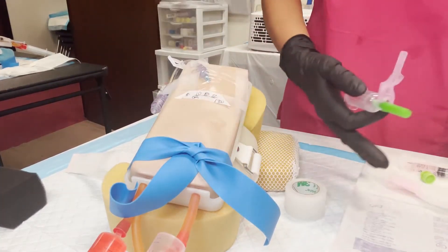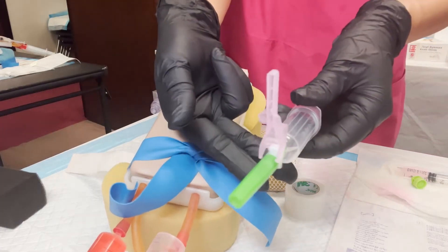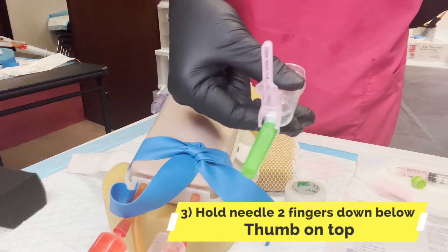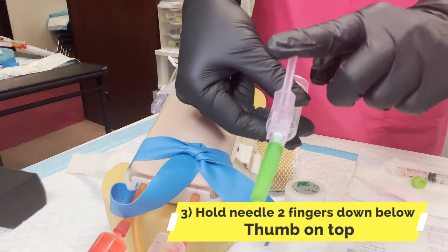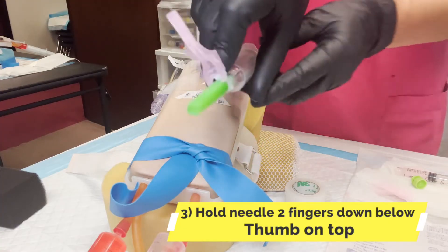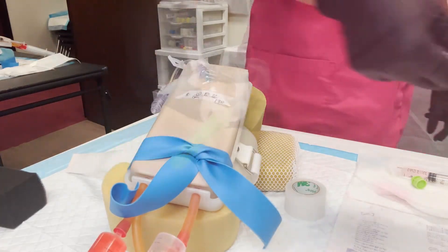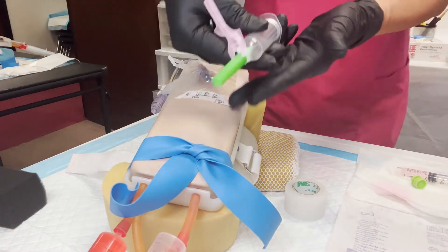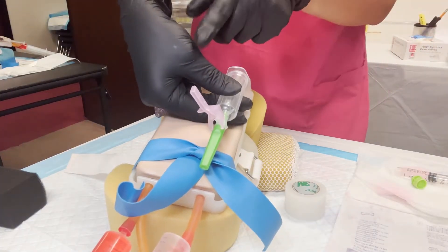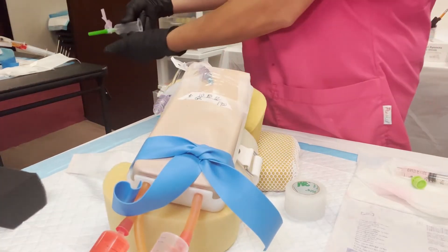Do we keep our sterile field sterile without packaging? Yes. This is how you hold this: two fingers below and thumb on the top, and this should be a line on the top — so it doesn't roll. Two fingers: what happens is these two fingers right here will land on the skin, and you never take this off. It stays there for the whole procedure. It lands on the skin.